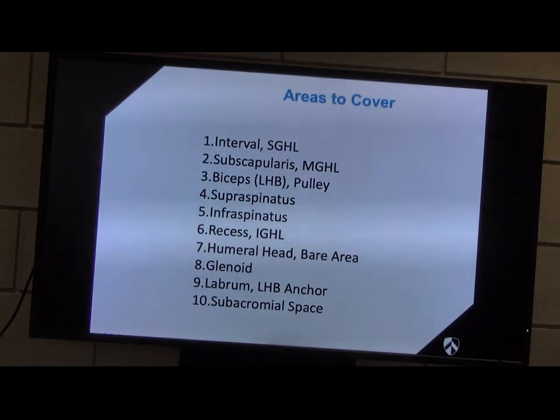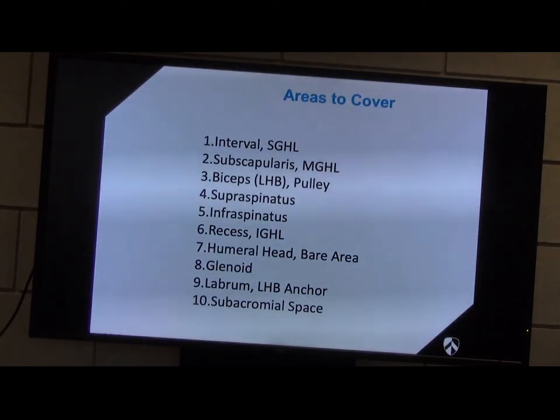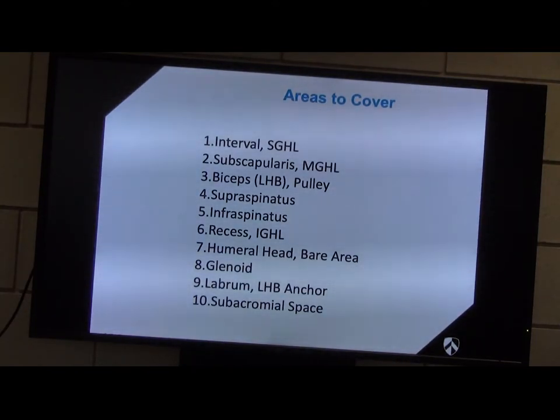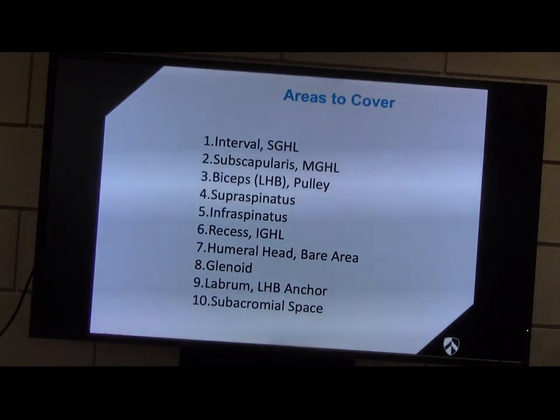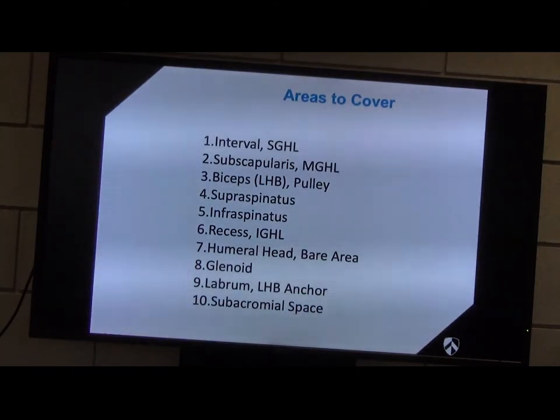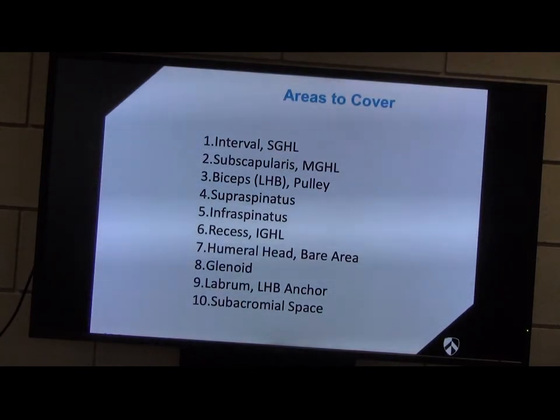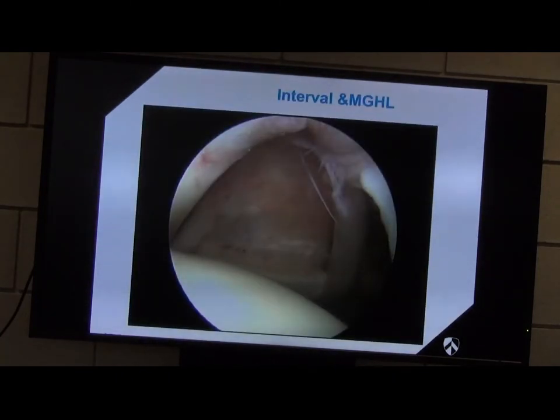These are the things we're going to look at in the rotator interval: the coracohumeral ligament, subscapularis and its attachments, biceps and its pulley, supraspinatus, infraspinatus, inferior recess, humeral head and the bare area, glenoid, labrum, and subacromial space. You just go through that in a sequential manner when you do your arthroscopy.